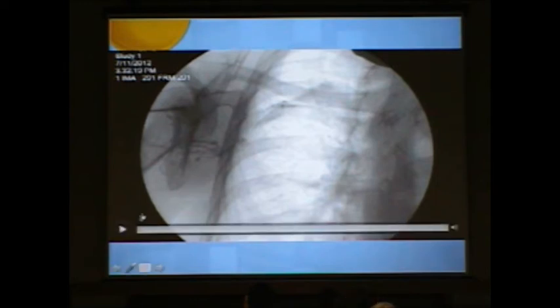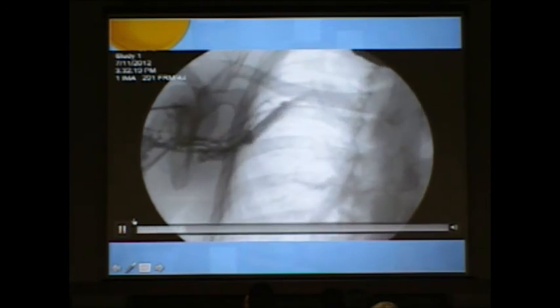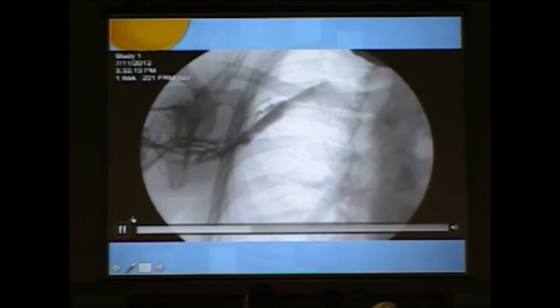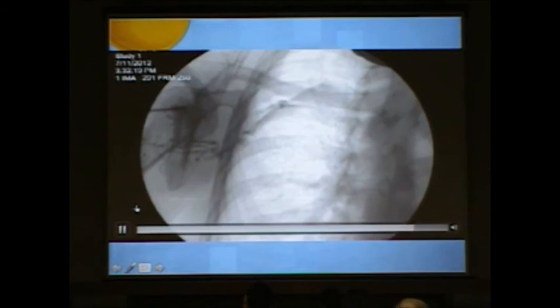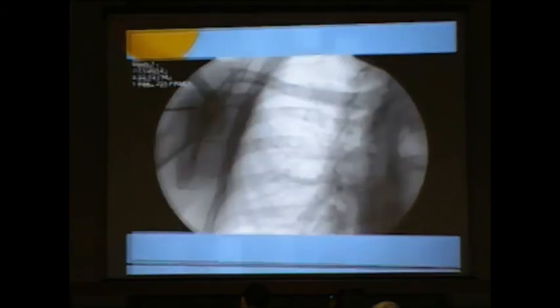That subclavian vein, by the way, is very difficult to cannulate when the patient is in shock. That vein will be collapsed because the patient is hypovolemic. The patient has low blood pressure. So this vessel is difficult to find in a shocky patient. So I urge you as clinicians to think about using the IO early on to stabilize the patient, resuscitate the patient, give them some volume, and then later on they can have a central line inserted more safely.